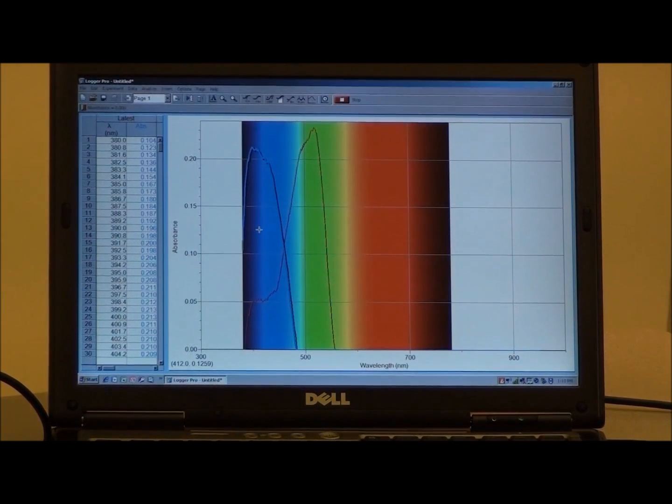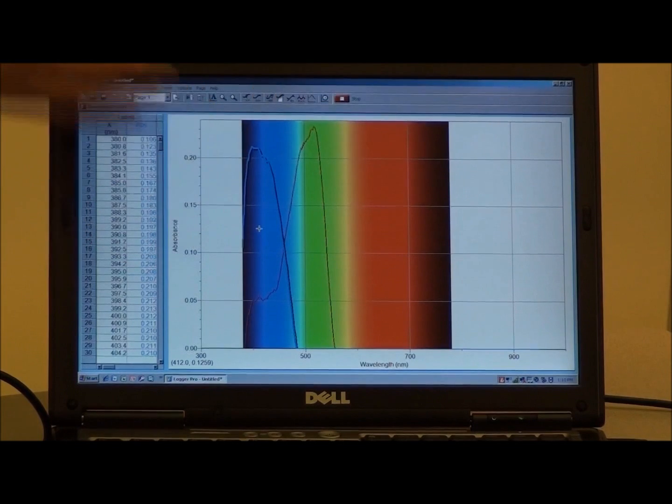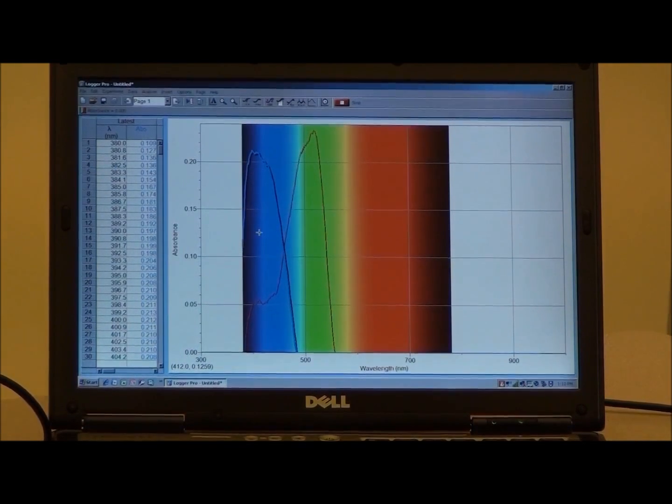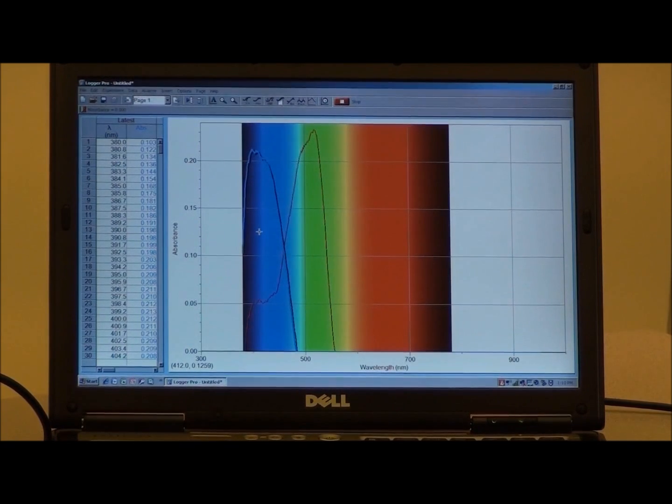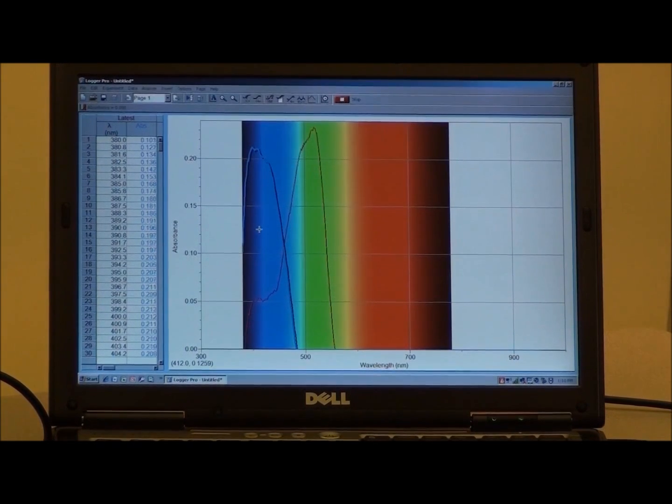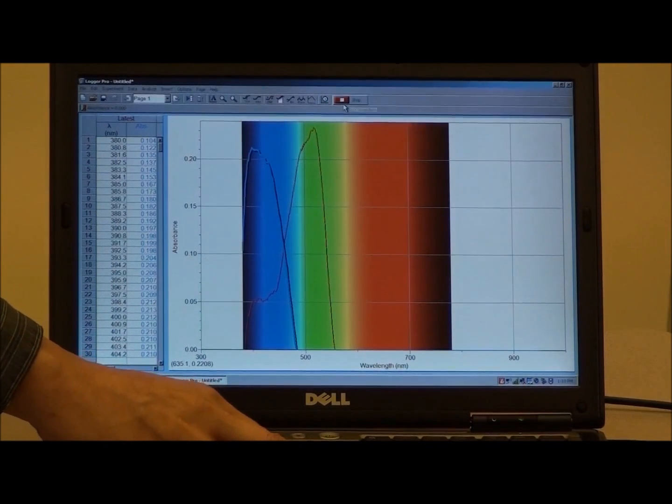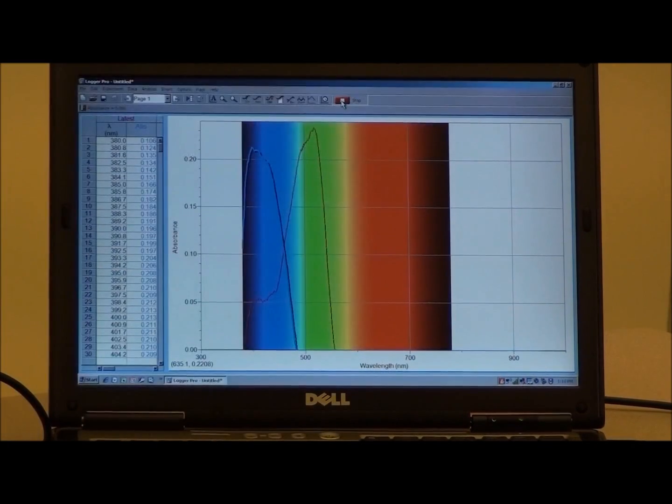The next solution that will be placed into the spectrophotometer is a yellow solution. Notice that the yellow solution strongly absorbs in the blue and violet regions of the electromagnetic spectrum. Once again, we will stop the data collection and keep that data displayed.